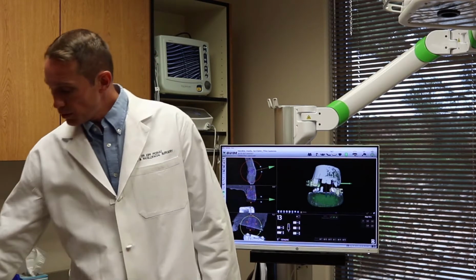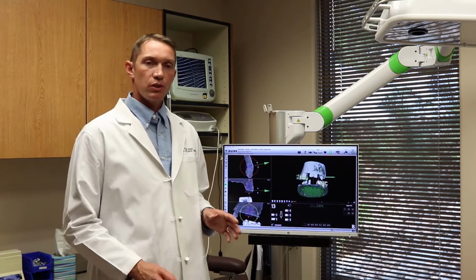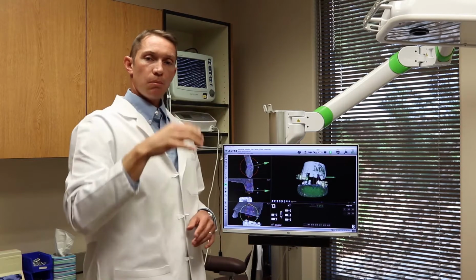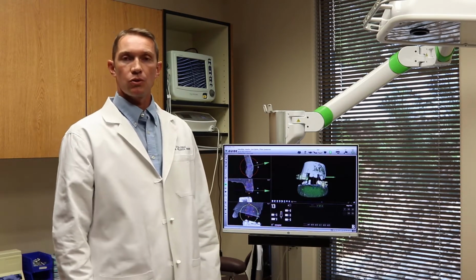So what we do is on the consultation, we use a small clip such as this. This is thermoplastic plastic that sits on the teeth, and then you get scanned in the CT machine. From there, the CT scan gets uploaded to the X-Guide software. During the procedure, you'll wear the clip in your mouth, and there's a reader here that will read the position of the clip and tell this machine where your mouth is in relation to the CT scan that we had taken. There's also a reader in the drill that I use to place the implants.